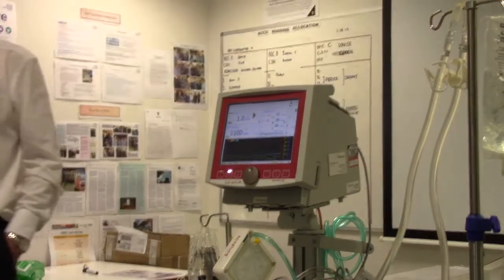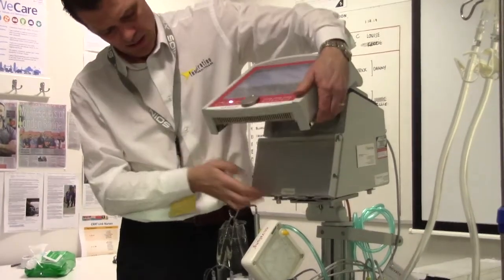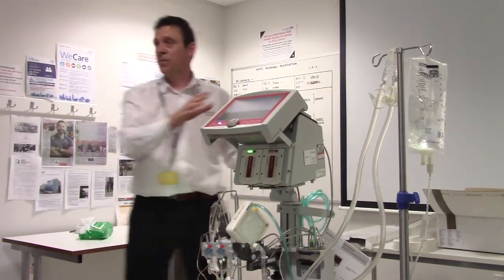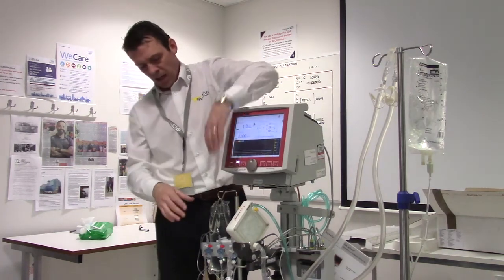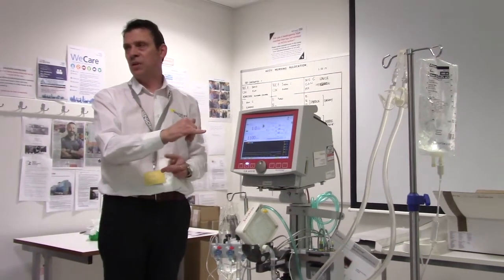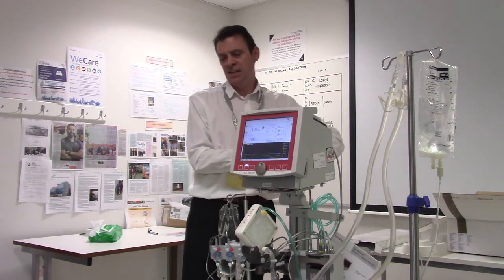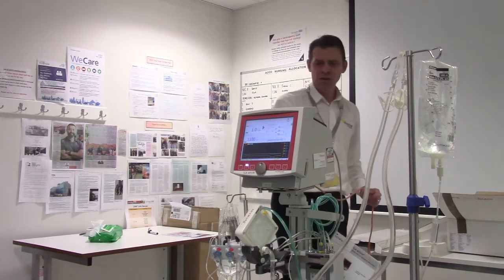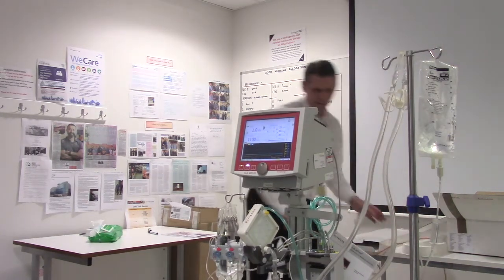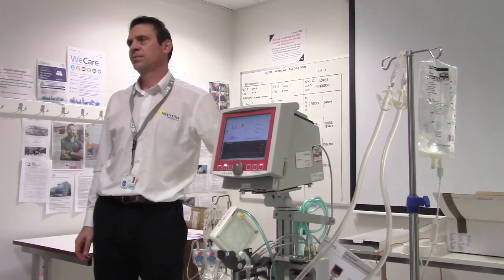If you need to transfer the patient for a scanner, can you disconnect and reconnect? Yes. It has battery backup — batteries are in here. The best thing to do is take the whole system because you still have full monitoring. If you just took the lung and impeller on their own, you wouldn't have full monitoring of blood flow. CT is going to be tricky because of the length of line going into the patient, but the system is portable next to the bed for back to theatres or wherever you need to go.